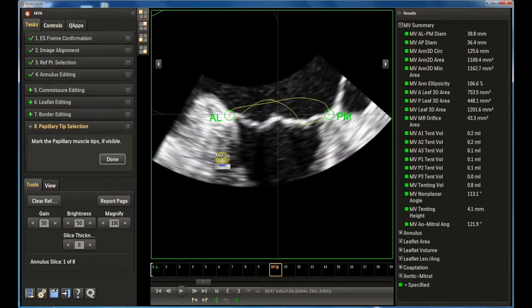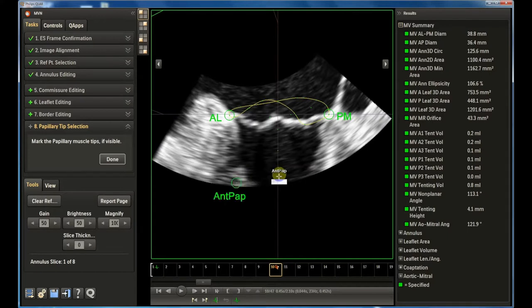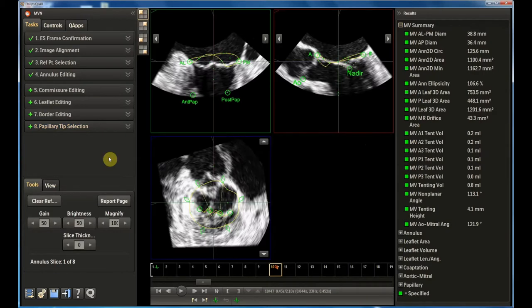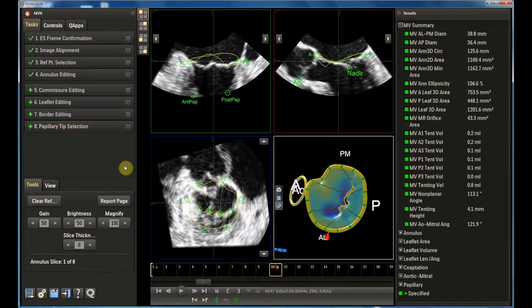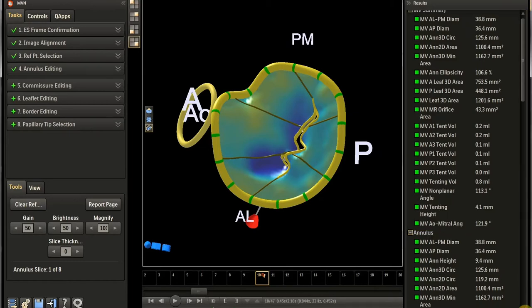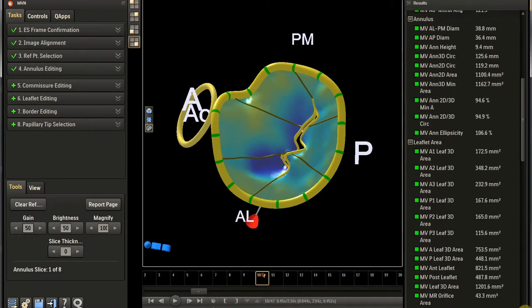The last step is to place the papillary muscle tips if feasible. In this case we can only guess their position. This is the final result of the segmentation, and these are all the variables that can be extracted by the model.